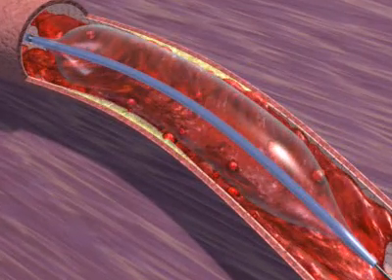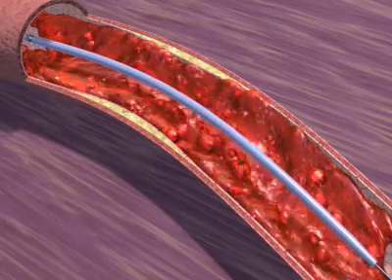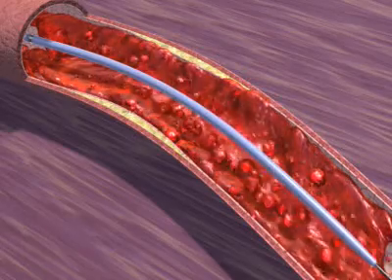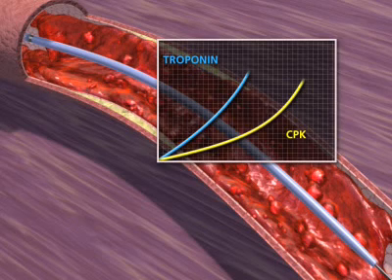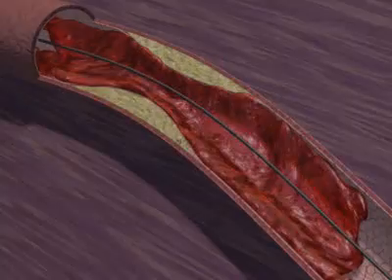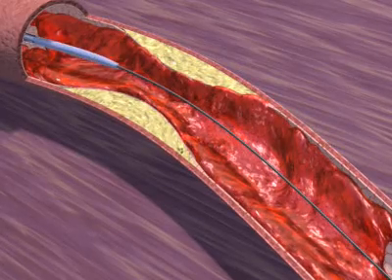Balloon dilatation is first performed. Dissolution of the thrombus results in distal microembolization. Occlusion of the distal microvascular circulation increases myocardial injury, which may be reflected in further increased myocardial enzyme levels and additional myocardial damage. Following balloon dilatation, a long atherothrombotic lesion remains.